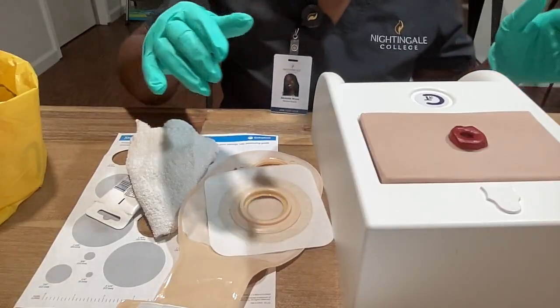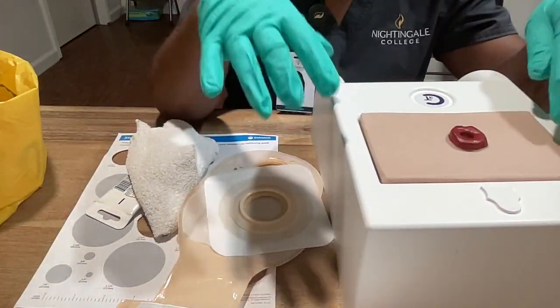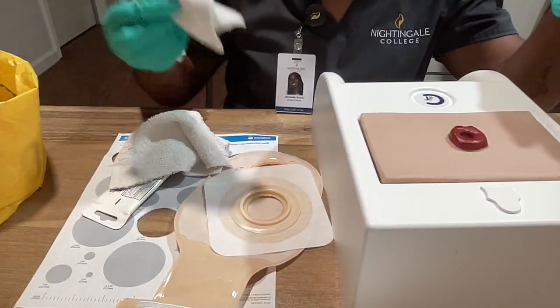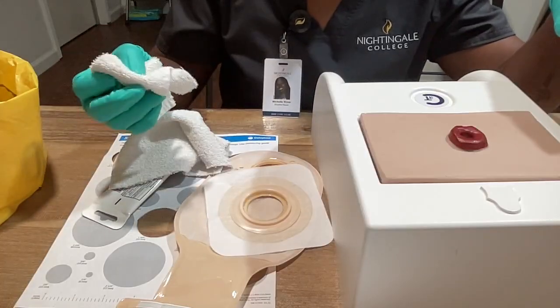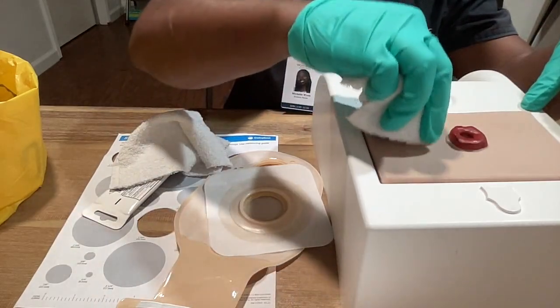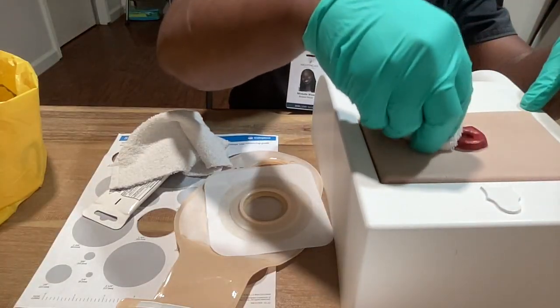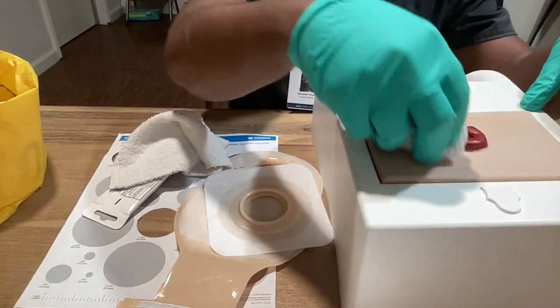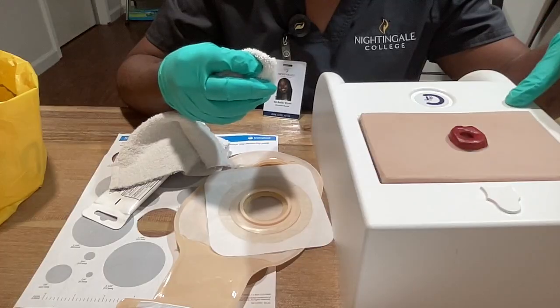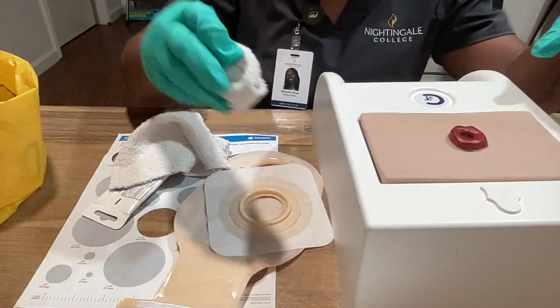How's everything, Ms. Jones? Now that everything is off, I would like to clean your stoma area. I have warm water and the approved solution. I am cleaning around it. When cleaning, you want to make sure that you always start with the inside and then move towards the outside. In the process of cleaning, if you touch it and it bleeds a little, that's okay — that's normal. I'm going to dispose of this.